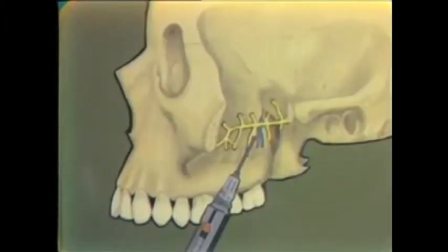Graphically, we see the position of the syringe and needle bevel at the posterior superior alveolar foramina. In so doing this way, we can stay out of the pterygoid plexus of veins. With the posterior superior alveolar injection, of course, we anesthetize the third molar, the second molar, and the first molar, with the exception of the mesiobuccal root, adjacent bone, and buccal alveolar soft tissues.